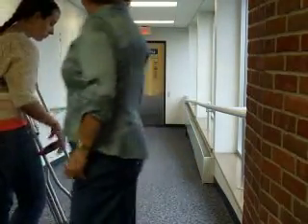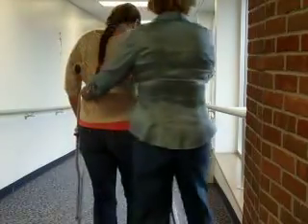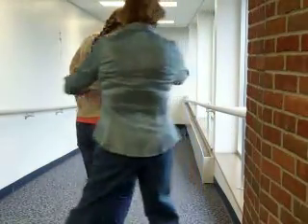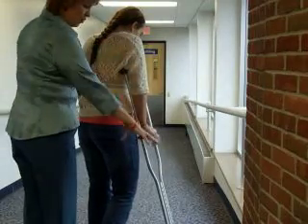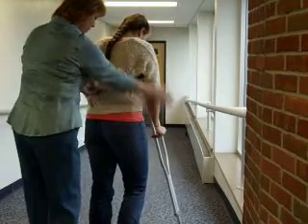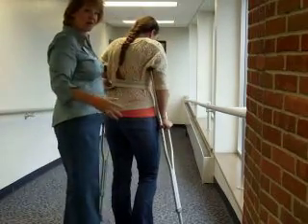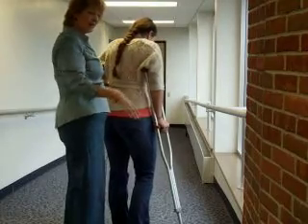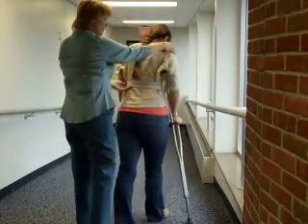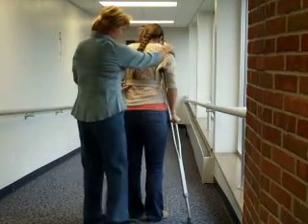I'm still going to be behind and to the involved side. So crutches down, and then partial weight-bearing on this foot. Now if she angles too much, then she ends up crossing her legs — we don't want that. So just enough of an angle to have some momentum stopped, and then make sure you're walking straight down toward the door.